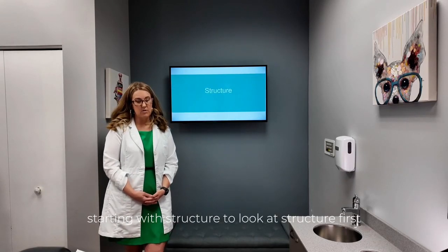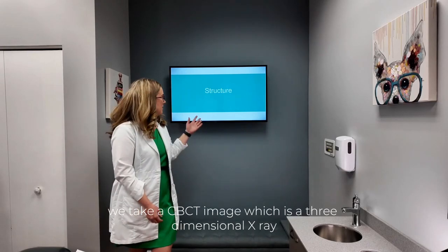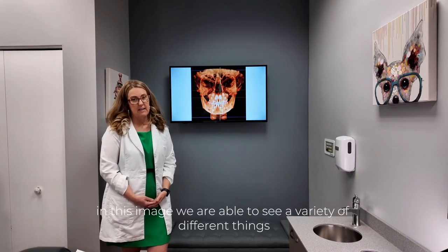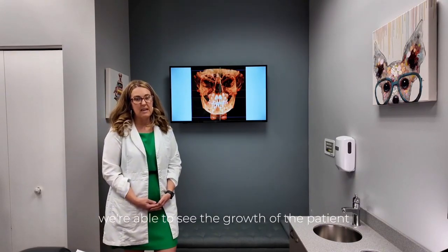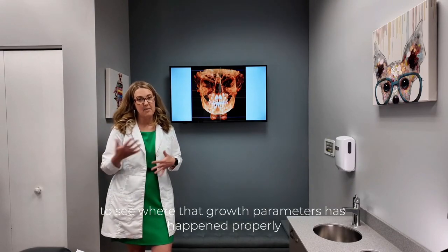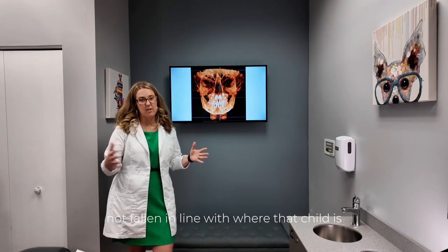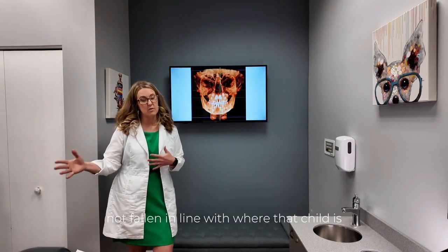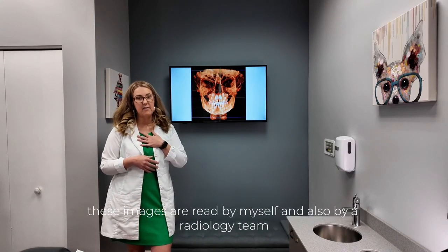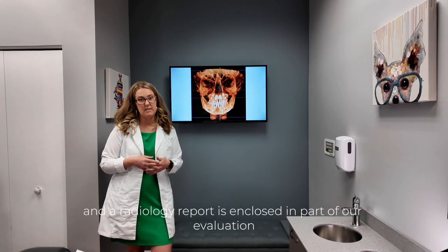Starting with structure. To look at structure, first we take a CBCT image, which is a 3-dimensional X-ray. In this image, we are able to see a variety of different things. We're able to see the growth of the patient. We are able to take measurements to see where those growth parameters have happened properly or where those growth parameters have not fallen in line with where that child or adult should be based on their age. These images are read by myself and also by a radiology team, and a radiology report is enclosed as part of our evaluation.